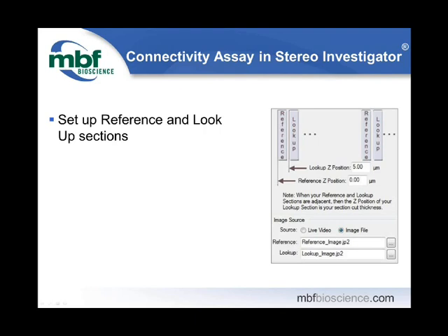And addressing again the question we heard earlier about the minimum number of sections, you have to remember you're trying to give the whole lung equal opportunity to be sampled. And depending on what you're looking for and how different the result may be, you might have to sample more frequently or less frequently.